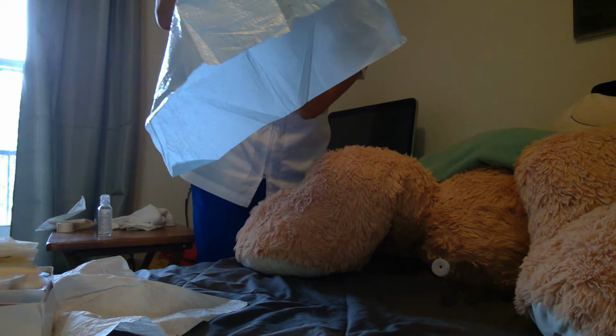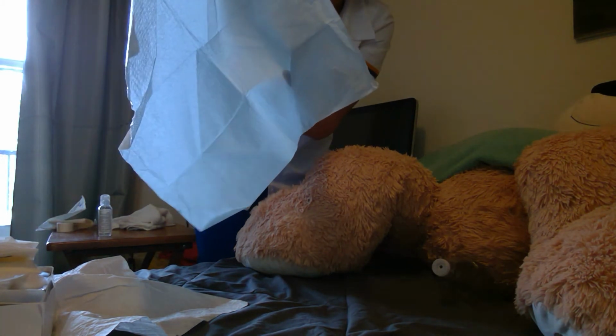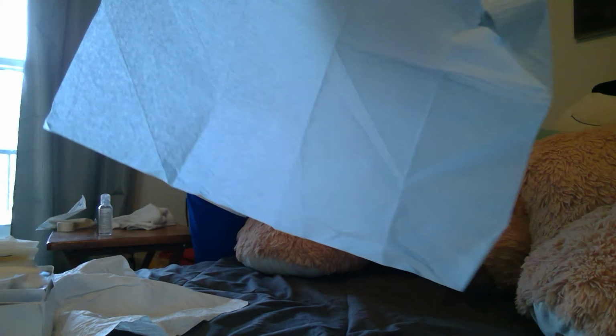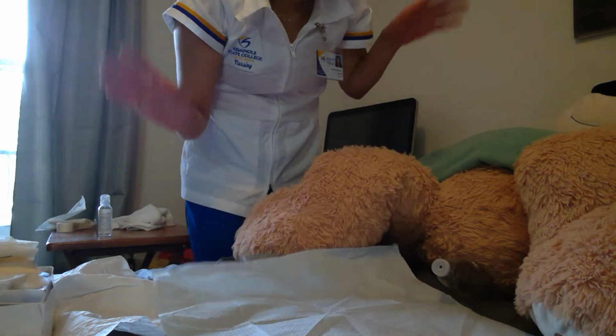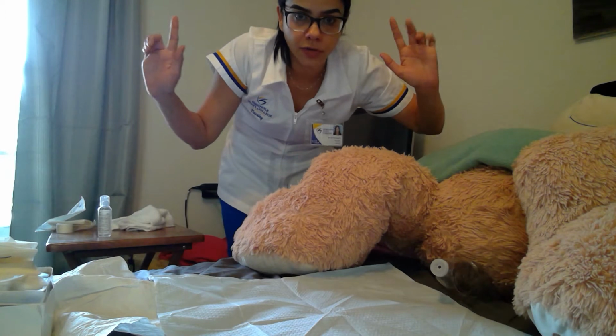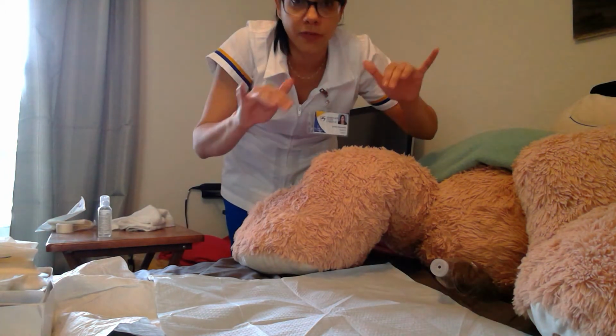I can touch maybe one corner over here, but always touching the shiny part, not touching the inside. And I'm going to put it here, and if it doesn't fit the way I want, then that's fine. Once I put my sterile gloves on, I'm gonna be able to fix it.